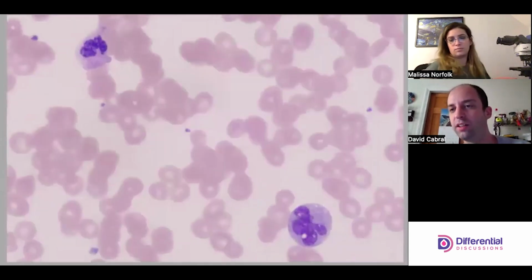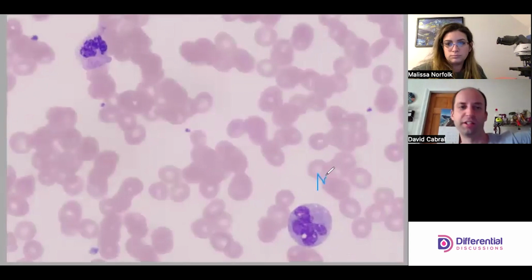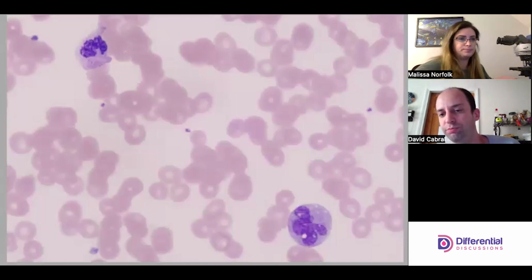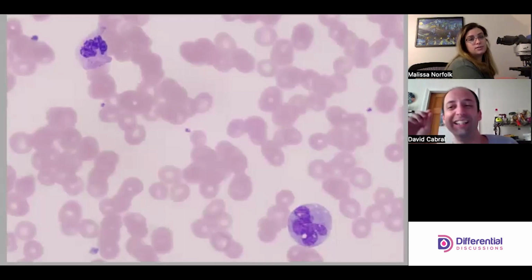Okay. So it's good to have a contrasting, a mature monocyte in the bottom right here, right? And we have the neutrophil in the top left, just for completeness here. But yeah, we see a mono with a pleomorphic nucleus, right? And then we see dark clumping in here as well. So a nice, happy, normal looking mono. Yep. You could see the size difference too, huh? In the overall cell size. Yeah. Even though we are getting a little thicker. Yep.